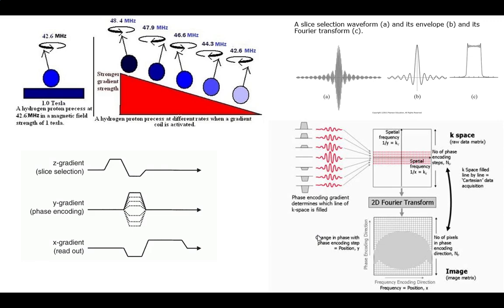Okay, so I think I understand the y-axis of the 2D plot of the K-space. What does the x-axis represent? The x-axis is going to be your x spatial axis. By setting a gradient in the x direction during readout, and it's small, it'll perturb things, depending on how you set the dephasing and when you set the measurement time.